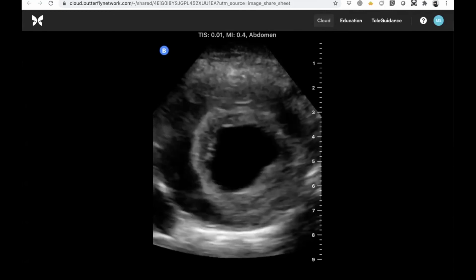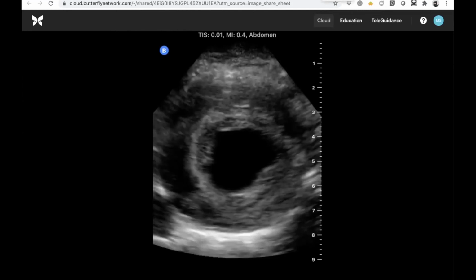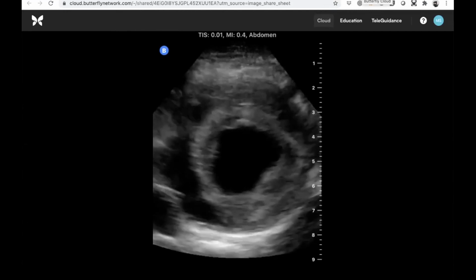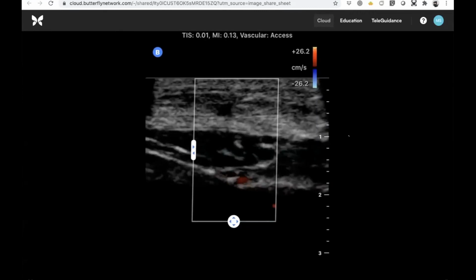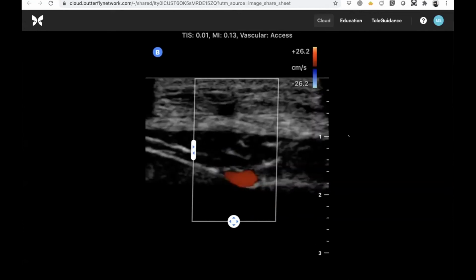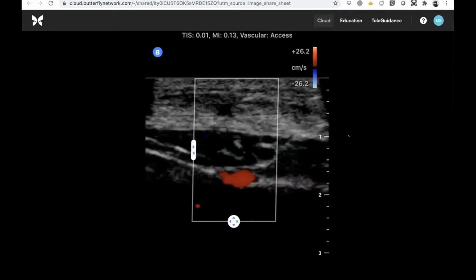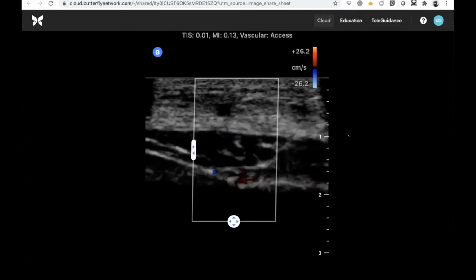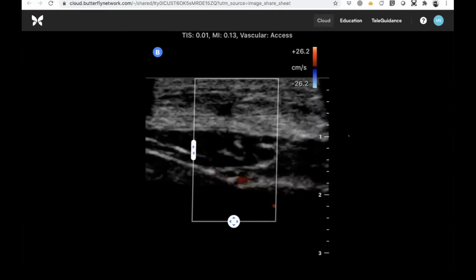So cool. Well, even just like the bladder, we could spend the whole rest of the time on this one image, but we're going to move on. I do want to give Brian one more little props here for this study, which I thought was really cool and is a cool example of pre-procedural safety improvements that you can get by incorporating POCUS into your practice. And I'll just describe what we're seeing here, and then Rach, I'm sure you'll have some tips and thoughts on this.